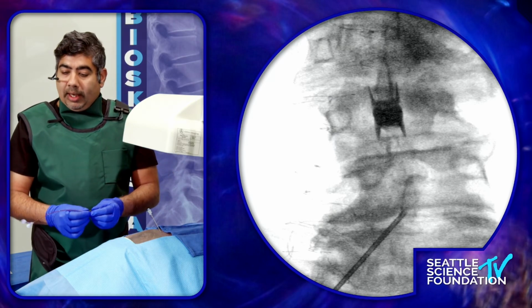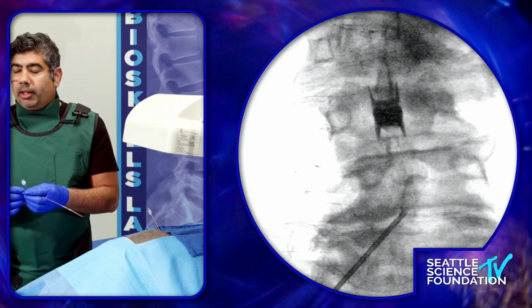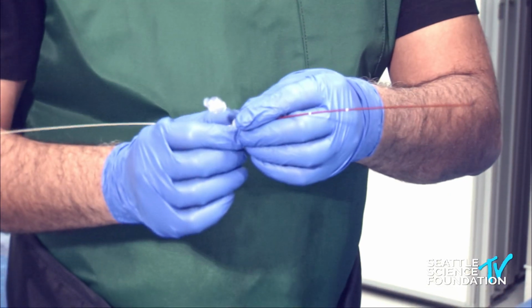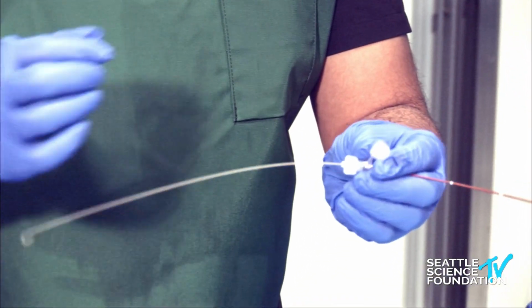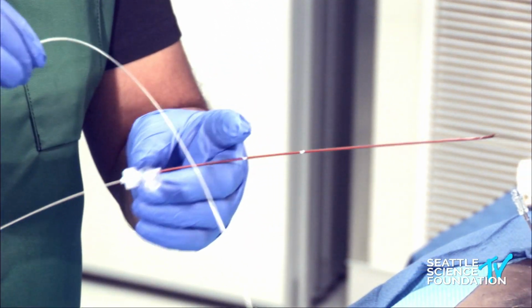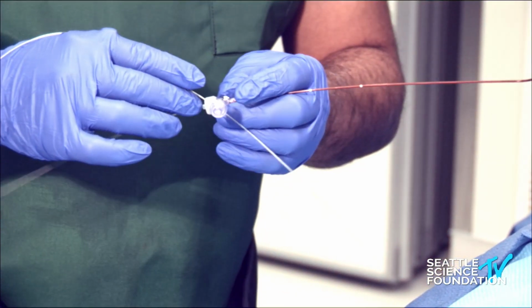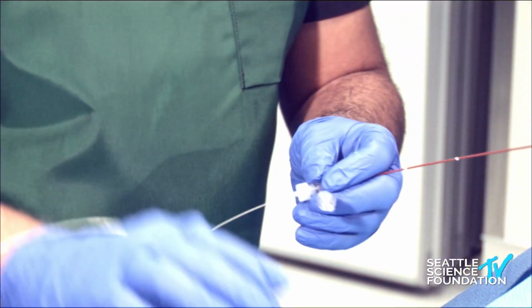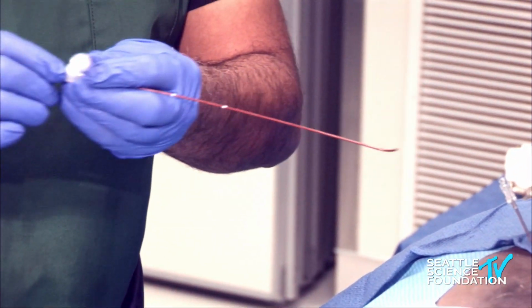So the needle is in, and you've got a loss of resistance. And there are two ways to do this. The kit which your rep will give you is pre-packaged with a sheath or the delivery system, and it's got a lead and a guide wire in it. Now, some people would put the lead in the sheath and then advance the delivery system, which is the sheath. I use the word driver, and basically park the electrodes in the foraminal space over your DRG. I use the guide wire. So I'll take the lead out and I'll put the guide wire in.